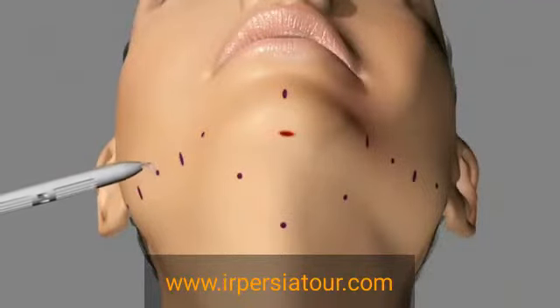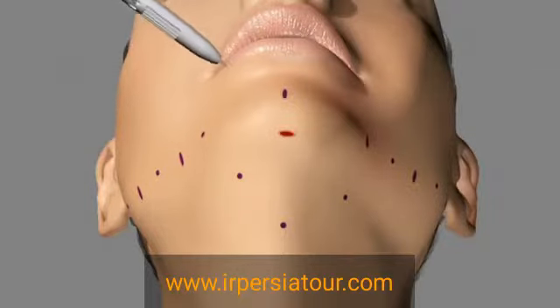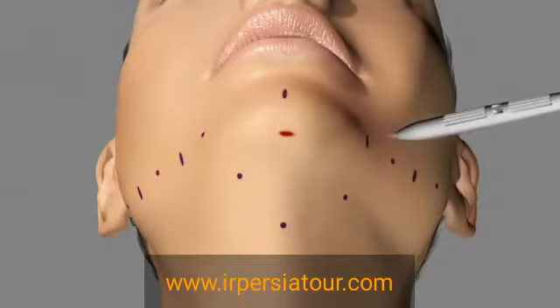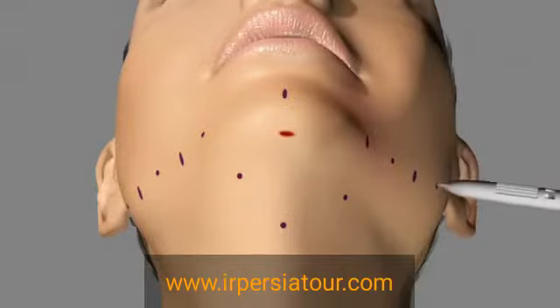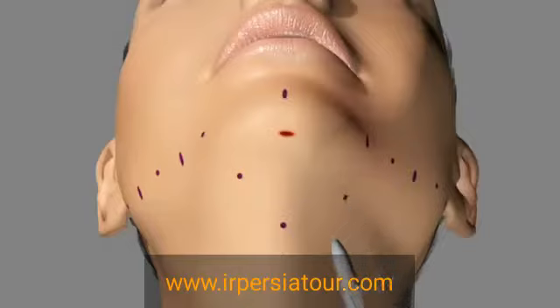The puncture device is then used to make a puncture in each of the marked sites. It is rotated to the left and right 1/2 turn, thus dilating the puncture. These are the anchor puncture sites on the lateral ramus, where the suture will be weaved around the ligamentous attachments. The area underneath the jawline, these are called pivot points that allow the pivoting of the rod as it travels around the curved surface of the jawline underneath the mandible.